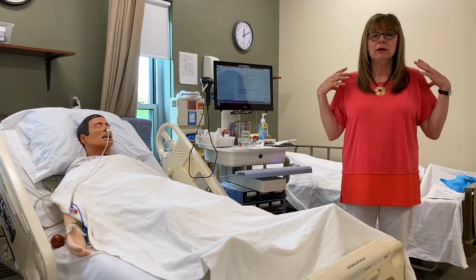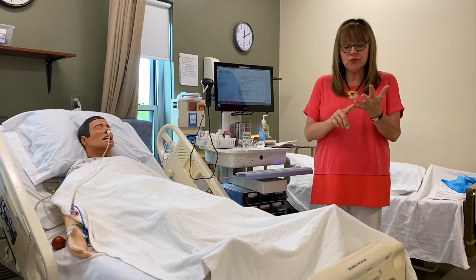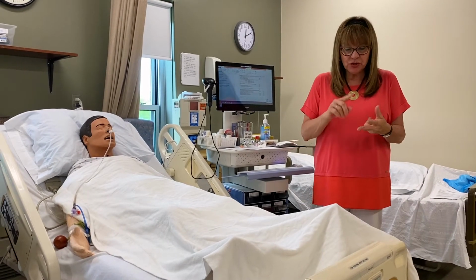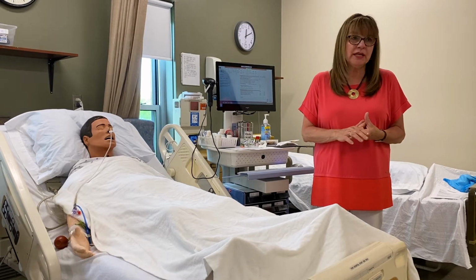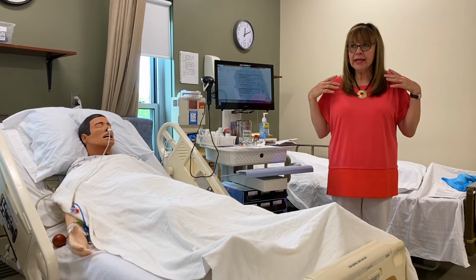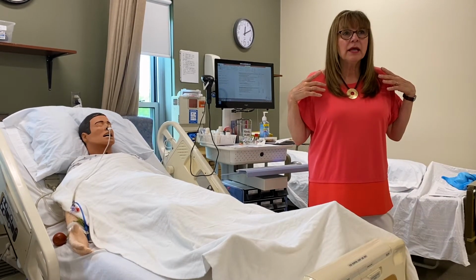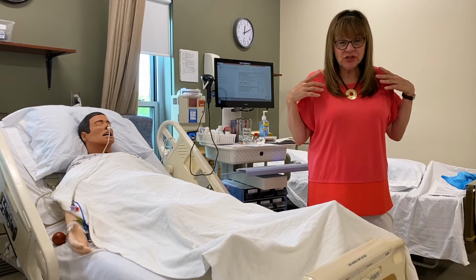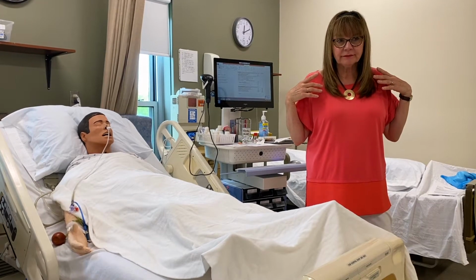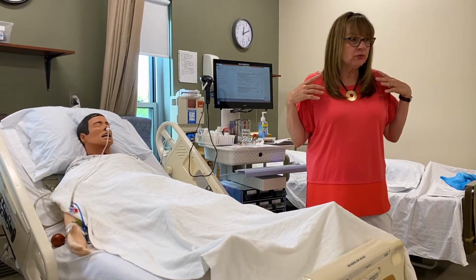Deltoid, you're going to use, first of all, for all intramuscular injections, 21 gauge to 22 gauge, 1 inch to 1 1/2 inch needle. So, if you're giving a medication in the deltoid, you can only give 1 ml, and you're going to use a 22 gauge needle, 1 inch needle. All vaccines are given in the deltoid.